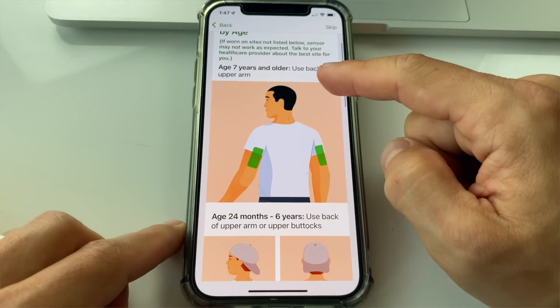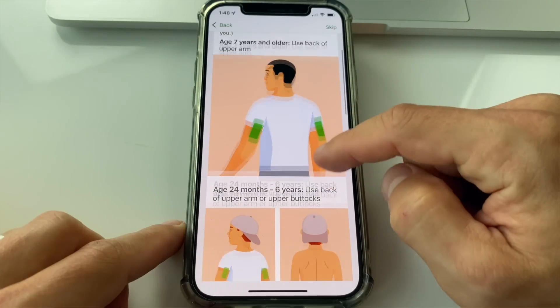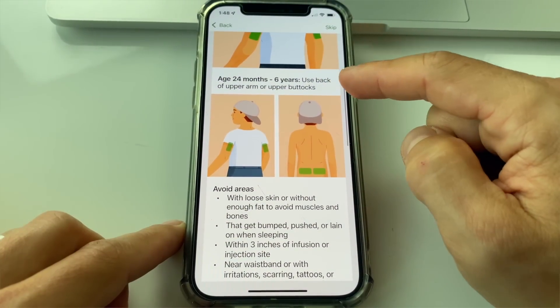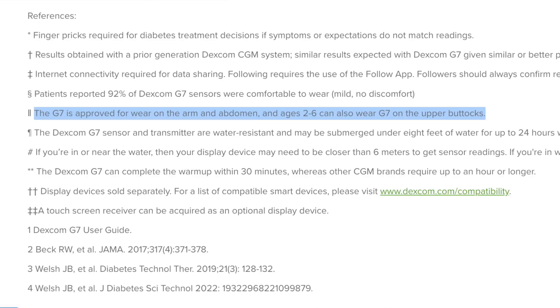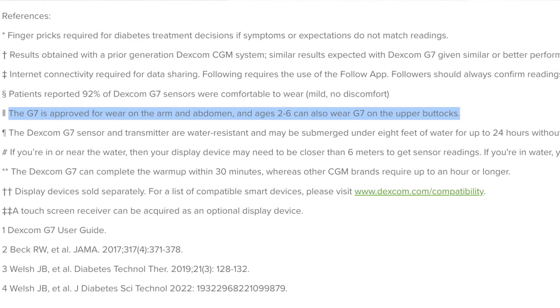What does that mean for you in real life? Let me first initiate my first sensor so I can show you everything. Choose the sensor side: if you're seven years old or older, use the back of the arm; if you're two to six years old, use the back of the arm or upper buttocks. On Dexcom's website it says the G7 can also be placed on the abdomen, so I assume that's an option, although the abdomen is not listed in the app.